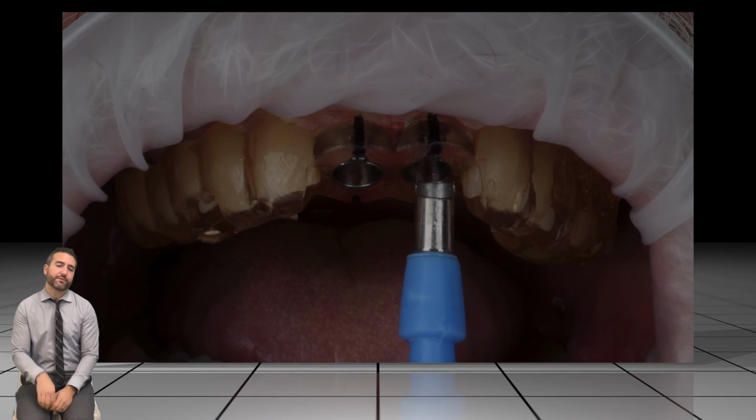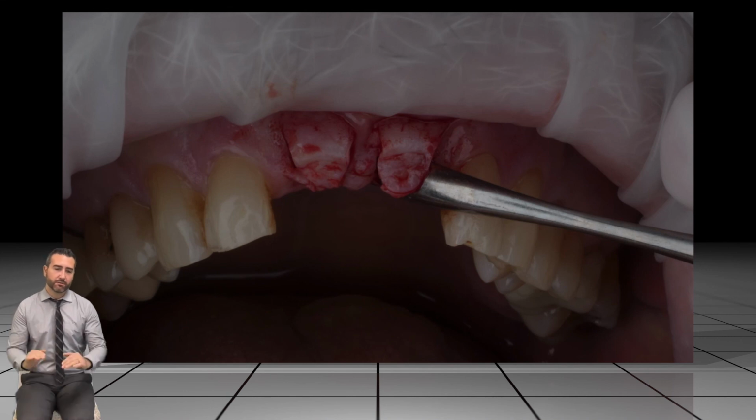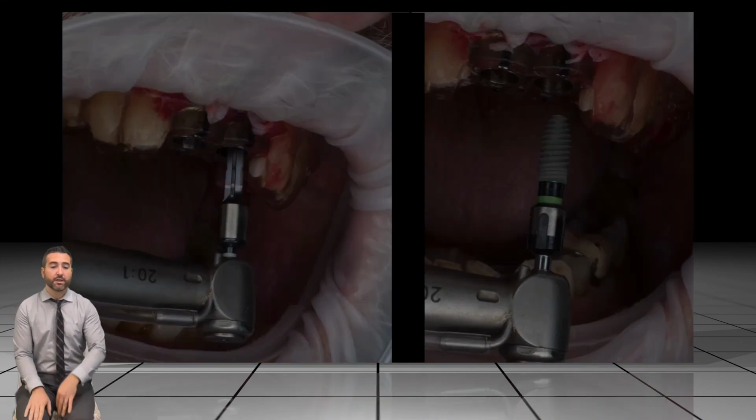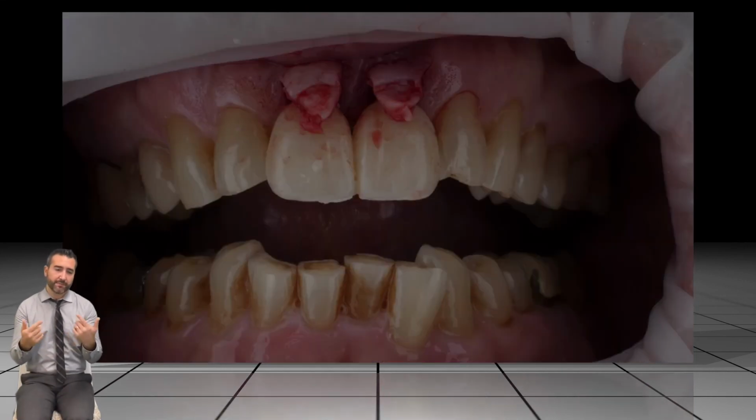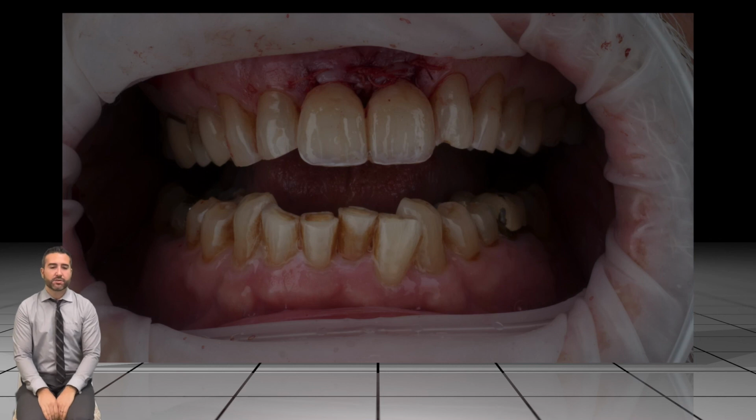So I'm going to go ahead and put that through the sleeve, and then I'm going to do these micro flaps where I'm just going to basically do these papilla sparing flaps here, where I'm going to go ahead and roll that keratinized tissue to the facial, place my implant, and then I'm going to do a roll graft where I'm going to go ahead and de-epithelialize and fold that into the papilla area and suture that so we get the papilla to grow there nice. And those are the prefabricated, pre-surgical prosthetics that were milled, zero work done, just screwed those in on the day of surgery. So I have to tell you guys, digital dentistry is phenomenal.